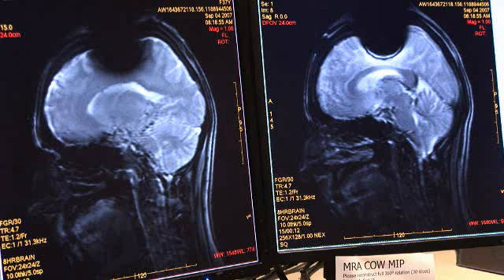First thing is the safety issue. They need to fill out a safety questionnaire listing all their previous surgery, whether they've had any kind of implants or metallic devices or anything like that. So that's a big issue. If they've had any of those kind of things, we have to check whether or not they're compatible with the magnetic field. Some of them are, some of them aren't.